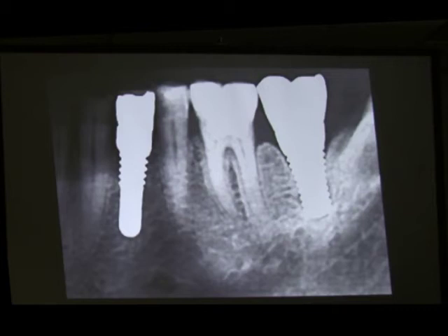I've been doing the CeraRoot for years now. I do the non-functional immediate restoration technique in the aesthetic zone on this particular implant all the time. It's beautiful with it. You just have to make sure that everything's out of occlusion, excursive movements, but otherwise I have great success with putting provisionals on at the same time and maintaining free gingival margins and the papilla. So, but it is technique sensitive. Exactly. You have to be careful with it. Yeah. But it can be done.